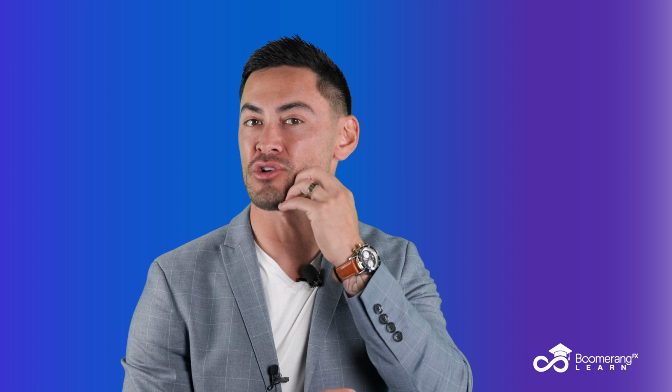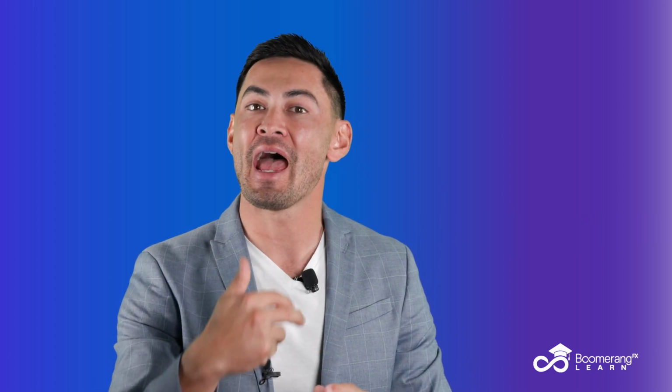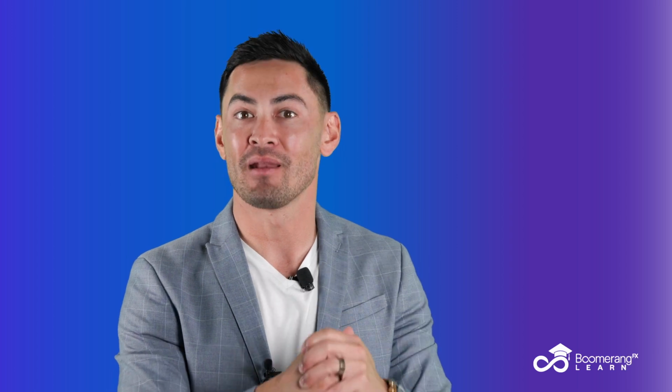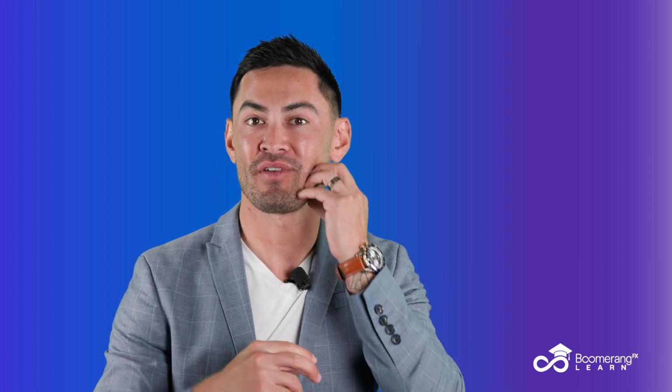I add some more tumescent. It's likely been under tumescent because I got to my temperatures quickly. So I add some more tumescent, which insulates this jawline better. And I can add more energy all the while trying to get to my 40-degree endpoint temperature. So I go 3.5, 3.5, now I have a symmetric treatment, and that's how I use those kilojoules to provide me context on my treatment.